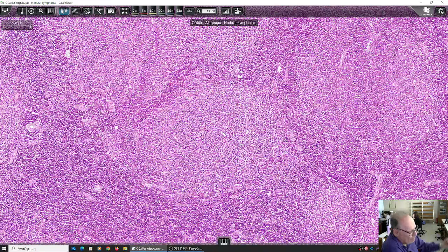So if we have a nodular lymphoma without the neoplastic giant cells of Hodgkin lymphoma, it is a non-Hodgkin lymphoma, then it is expected to be of B cells. In the normal lymph node, B cells form the follicles. So, this is probably a non-Hodgkin B cell lymphoma.